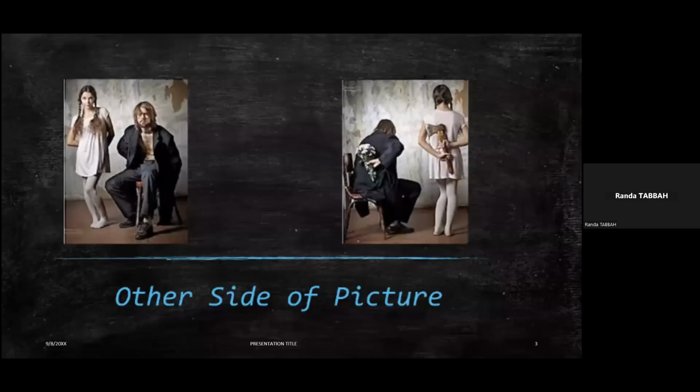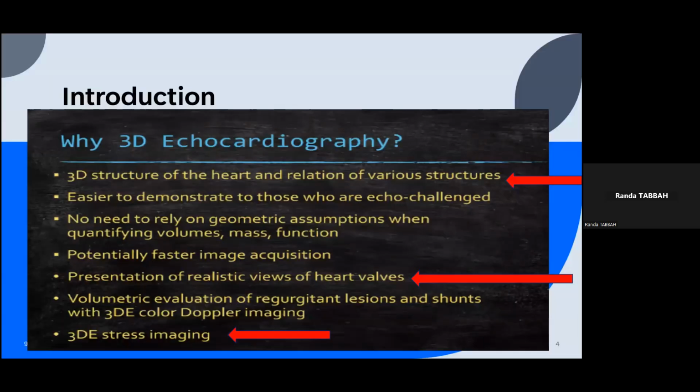So, first of all, if you can see this picture here, we always need to see the other side of the picture to understand. If you see here a small girl, a nice girl with a man, but when you see the other side of the picture, you can see that this girl is not a good girl. So we need to see all the sides of the picture to understand our echocardiographic studies. And that's why 3D echocardiography is very interesting.